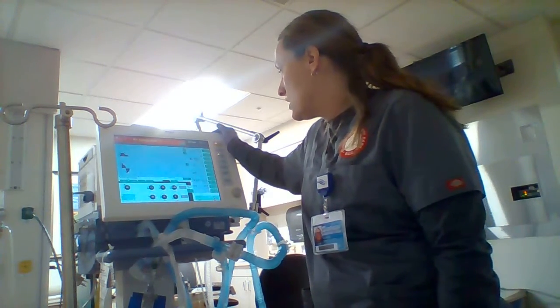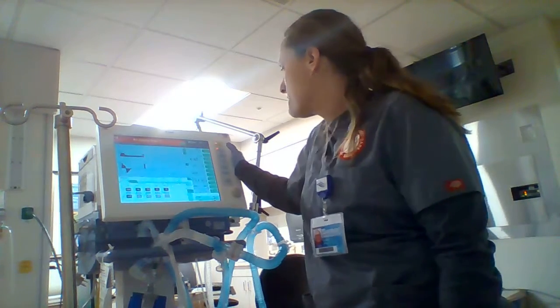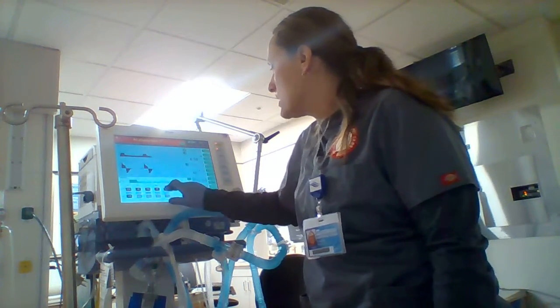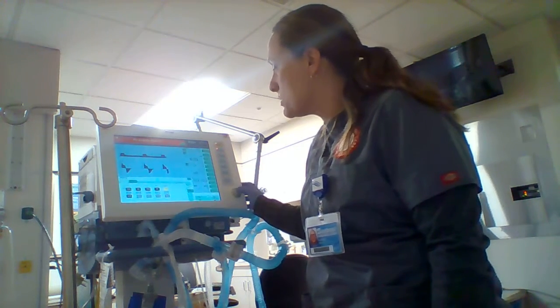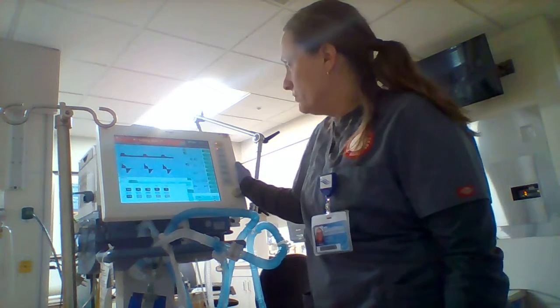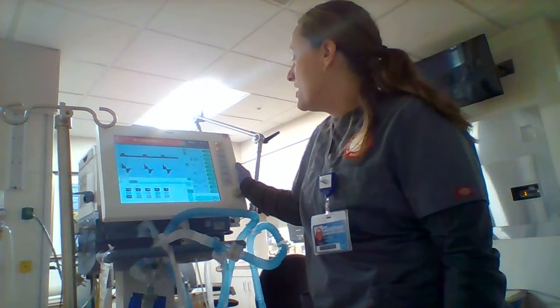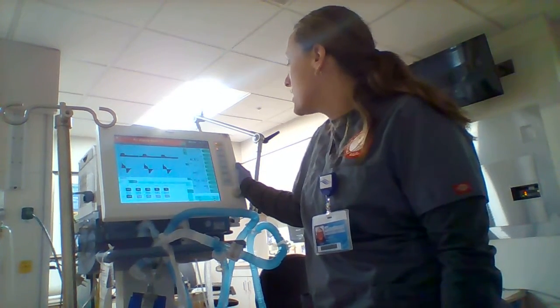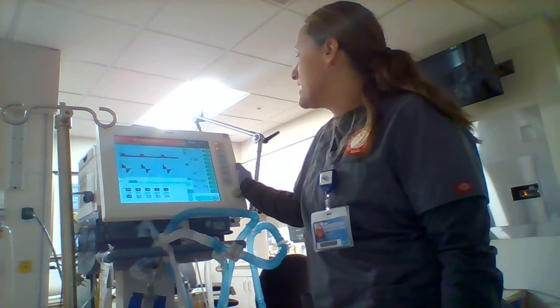Let's see my alarms. That means 20. Should be 15. That is their protocol here, and 20 must be the default. Oh, cool. We get really good tidal volumes with that. So tidal volume is 483 right now. Total frequency is 12, which is where I set it. Perfect.